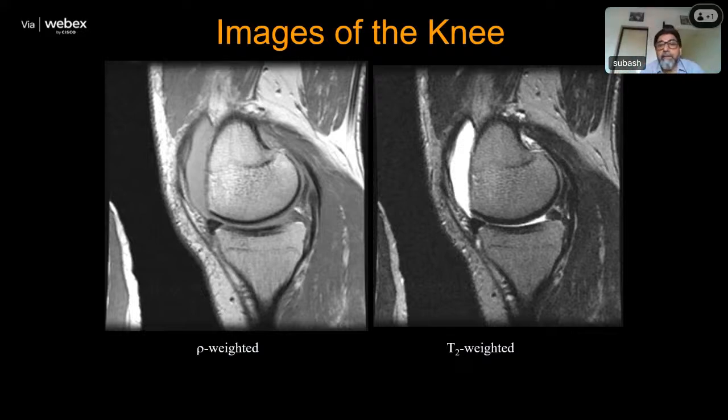You can see here a bright region, which is shown as I move my cursor. This is synovial fluid which has accumulated in the knee joint, and most people of elderly age have difficulty in walking and pain in the knee. Mostly ladies get this quite often beyond the age of 40-45. They complain of pain in the knee and difficulty in walking.